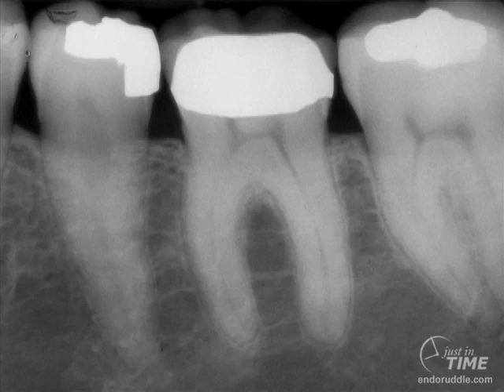Let's look at a clinical case and look at the technique now in continuity as we shape the mesial buccal canal of this mandibular first molar. Notice this first molar has a clinical crown on it, porcelain fused to metal. Notice the pulpal roof and floor are quite close in proximity. You can see the horns emanating up towards the occlusal table, and they disappear under the restorative. Importantly, notice the entry angle of the coronal 1/3 of the mesial systems into the pulp chamber. Note that awkward curvature into the chamber. The crown will be removed, but first let's just review the sequence.